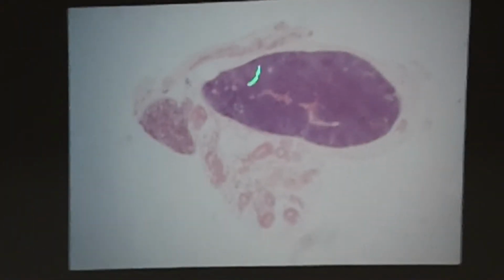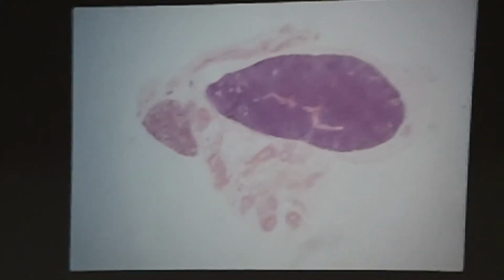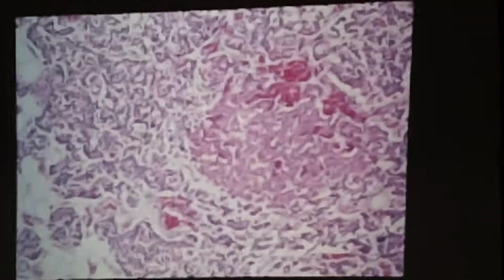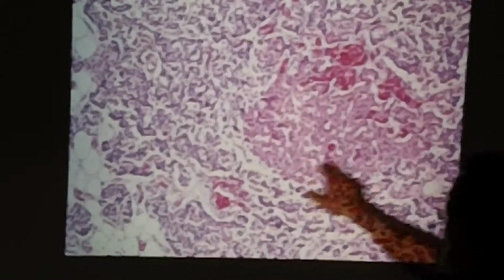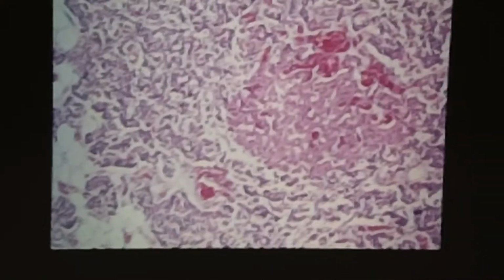So, purple staining, and the major question we're going to be asking ourselves first is, ducts or not? Since we know the parathyroid is an endocrine organ, it's not going to have ducts, which is going to cause us to pursue further, and we're going to want to look for clusters of oxyphil cells, or oxyphil cells singly.